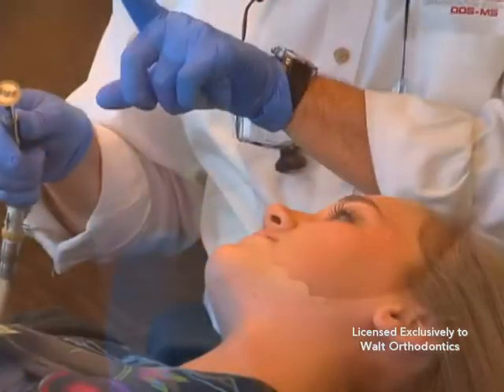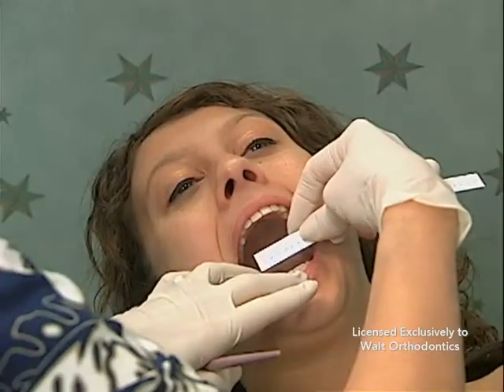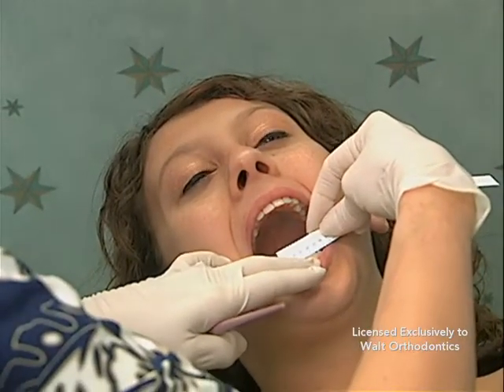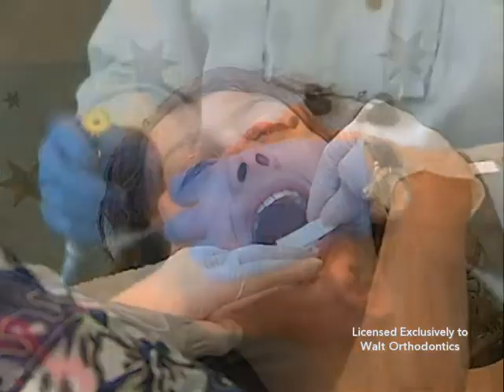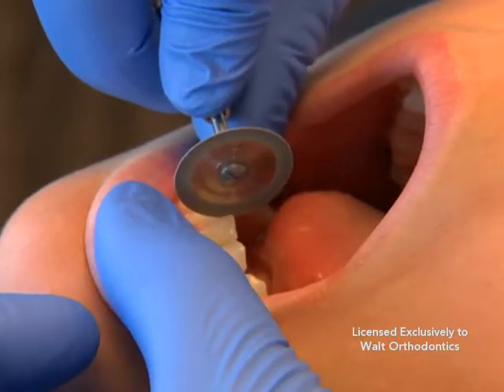IPR is typically done using a burr or disc attached to a dental handpiece. The first step is the measurement of the teeth and space required. Once determined, the burr is applied against the region to be stripped, reproximated, or slenderized.